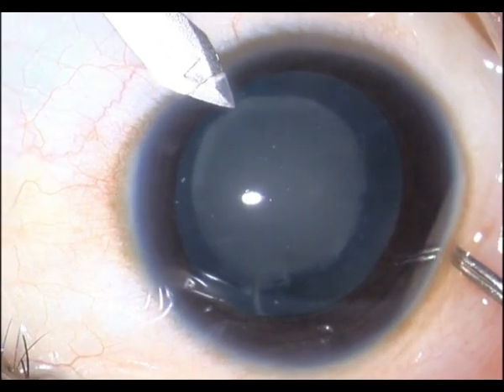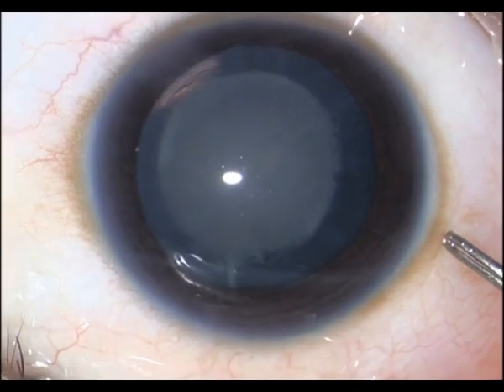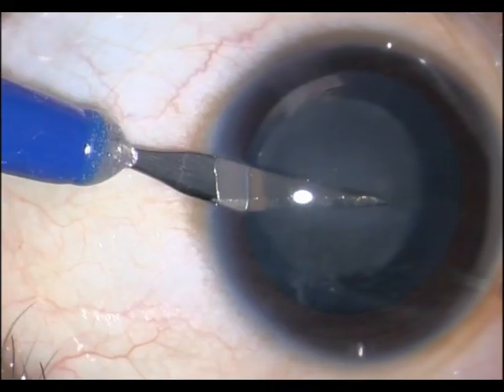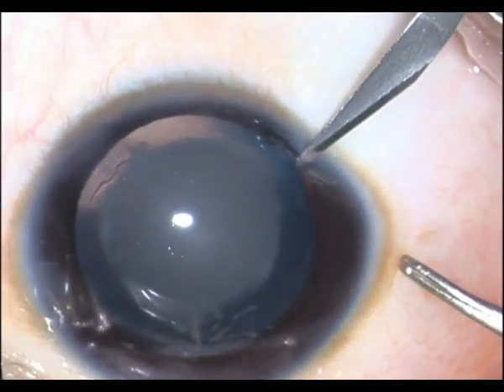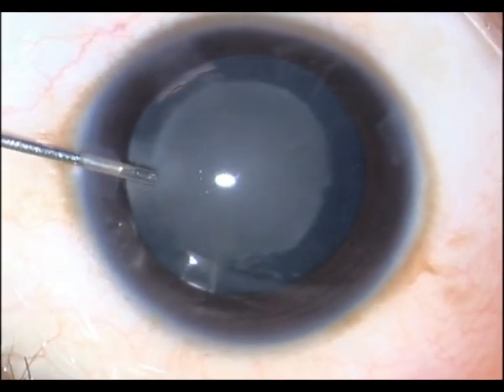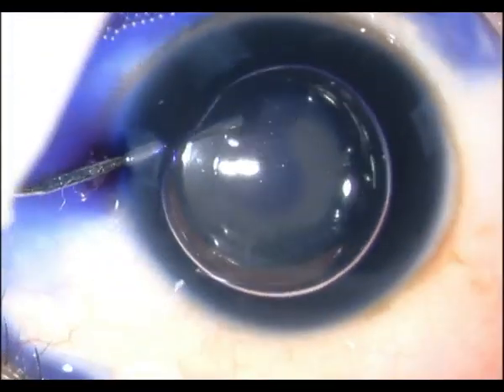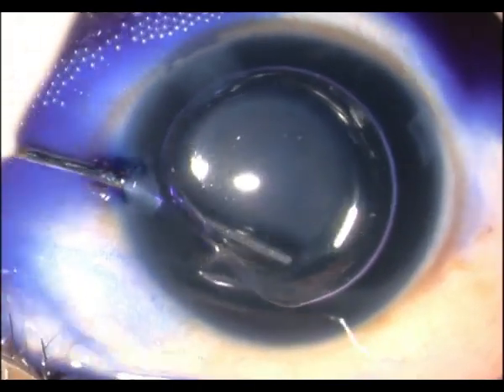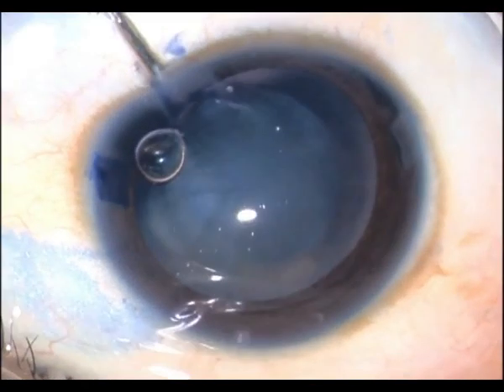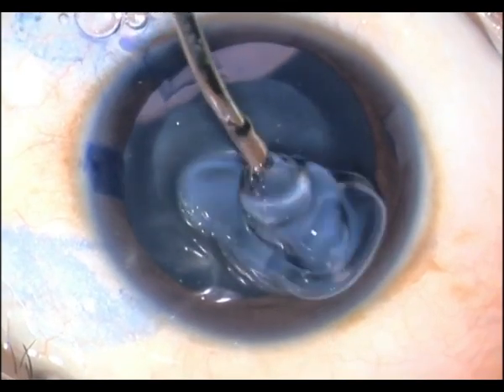Initially I take a 2.2 blade and make my phaco incision. I then place, as usual, two paracentesis wounds. I then place in an air bubble and stain the anterior capsule with trypan blue. I do this step mainly to make the capsule a little more taut — I use this property of the trypan blue rather than the staining property as such.